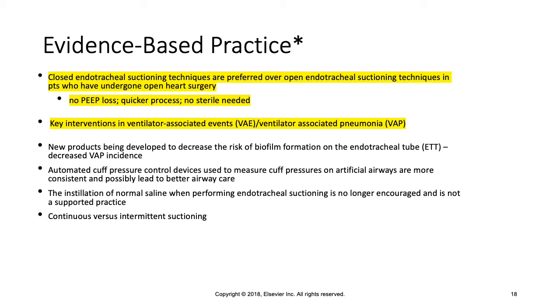Evidence no longer supports instilling normal saline when performing endotracheal suctioning. That was something that used to be done, but now it's not recommended. If there are microorganisms in the tube, this normal saline, usually it's not a whole lot that would be instilled, but it could push that further down into the lungs, so it's no longer recommended.